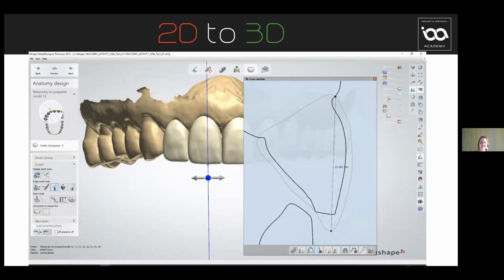So they have to almost be bulky and fit over the soft tissue, and then you reline and you trim them back. So that's super important. We learned after a few cases that was the way to go. So I hope you understand that. If you look at the buccal margin, you'll notice that the design of the shell temp finishes on the soft tissue. It doesn't finish on the neck of the tooth. So that was a big learning curve that we went through.